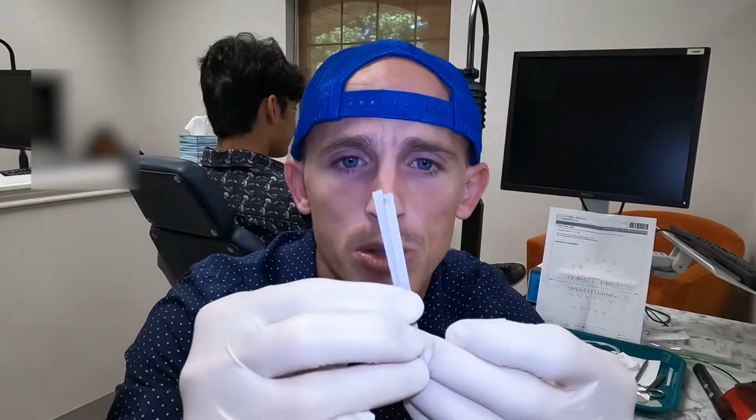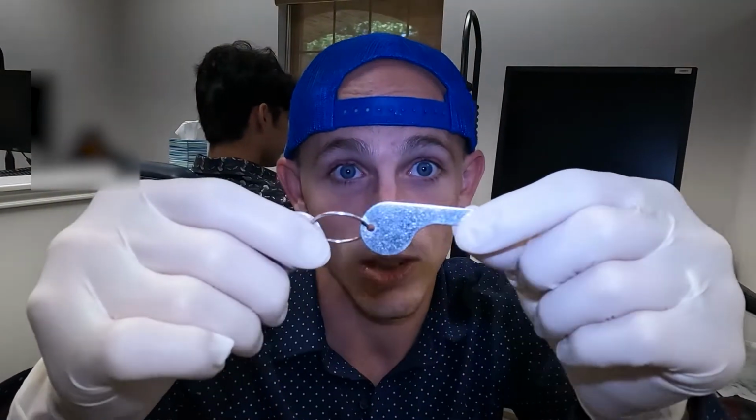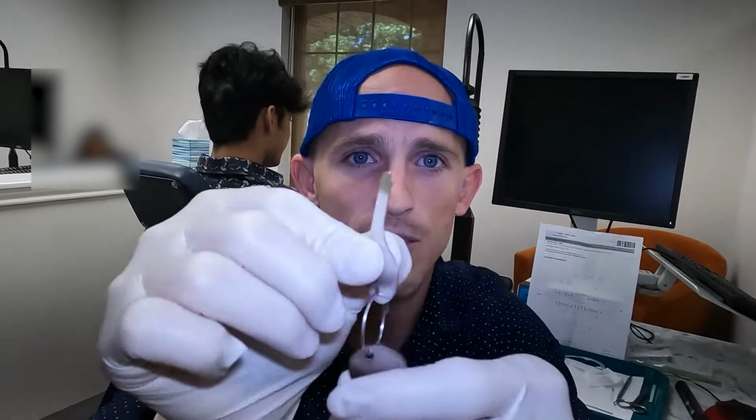Some providers will use these little sandpaper strips to help smooth some of the edges once they've done most of the work. This, in my opinion, feels the weirdest. And then we have what we call keys because they look like a key, all right? Each of them is a different width depending on how much space we want to create, how much shaving we want to do. So we do the shaving, and then we use these to check in between the teeth. If they slide down nice, then we're good. Let's show you how to do it.